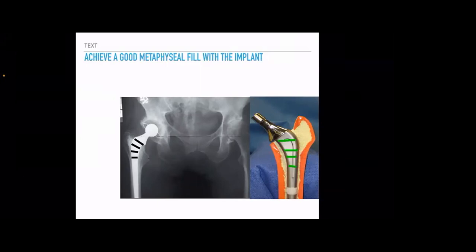stress failure there, because you have a well holding distal stem tip, while a very loose proximal part of the stem. So ultimately, there is a stress riser at the junction of the metaphysis and the shaft of the stem. So there might be breakage. We see lots of Indian implants breaking there because the metal used is not of so good quality. And if you have not done a good metaphyseal fit or even a distal femoral fit, they might fail over a period of time.